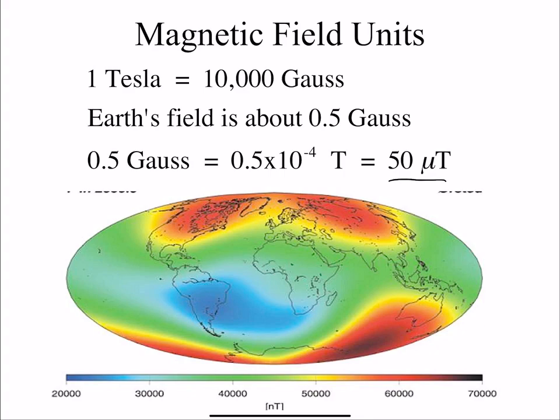That said, you actually can do MRI using Earth's magnetic field. So everything we're talking about here, you can actually do. Sometimes, I think it was done in Russia, they actually set up this big MRI system in the field so that they could look for oil. Okay, so you can actually do MRI using just the Earth's magnetic field.